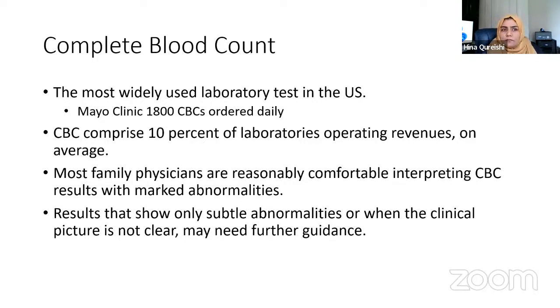As I mentioned, it's a very common test, and just to give you a number, the data from Mayo Clinic says that they do about 1,800 to 2,000 CBCs a day, which is a lot. So the core lab, which runs the CBC test through the automated hematology analyzers, even though it's done by the machine, there's a lot of process that goes on before the test is released to the patient chart, and I'll go through that process a little bit so you have an idea where a pathologist's role comes in when this test is ordered.